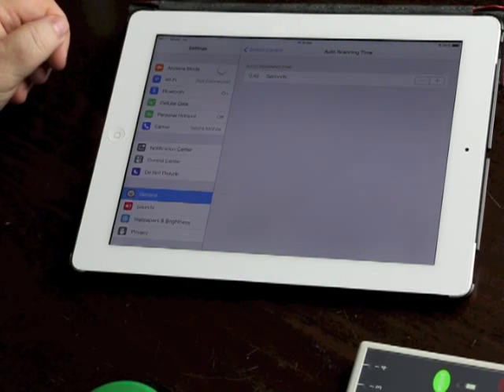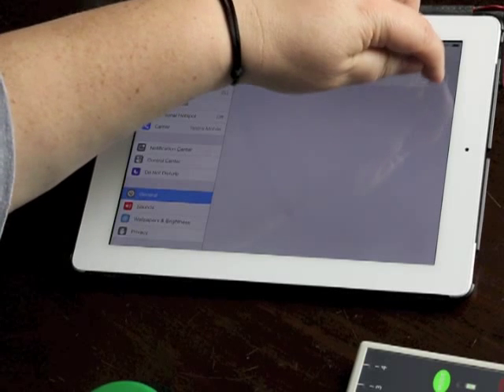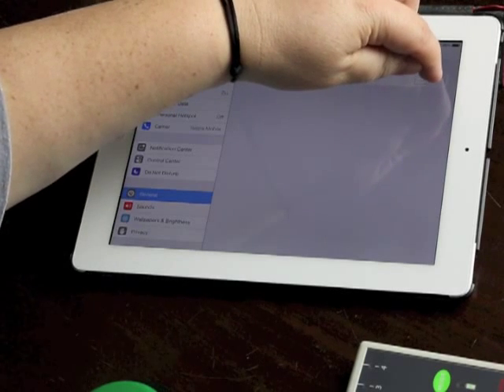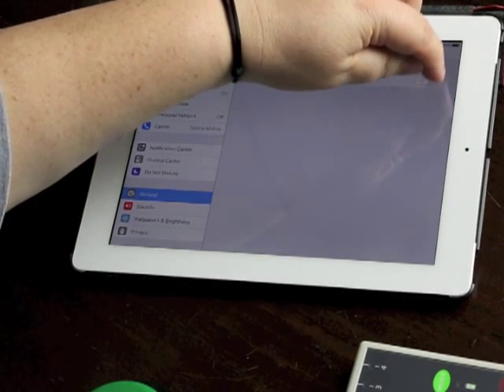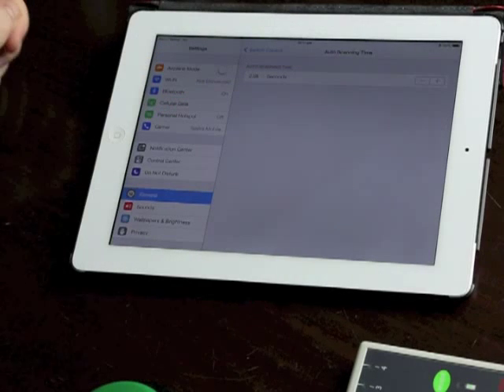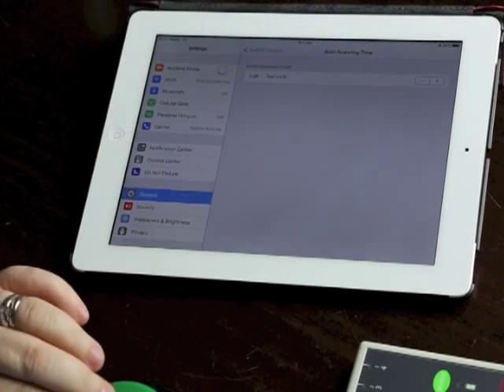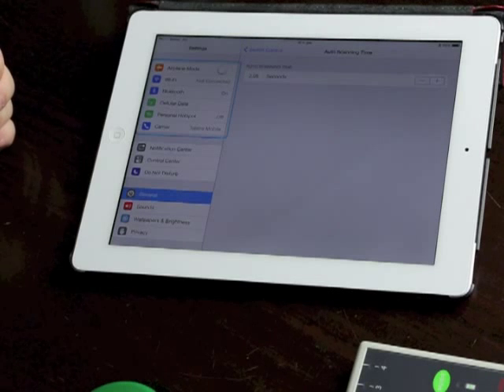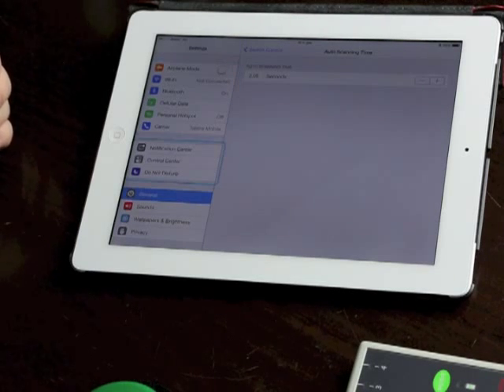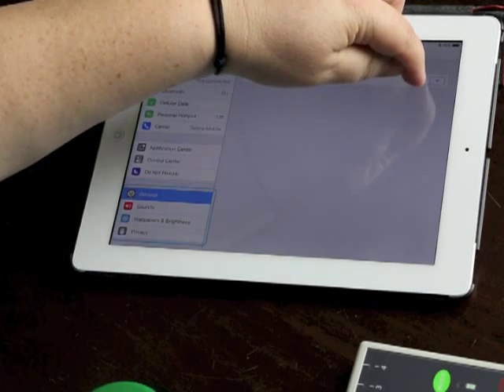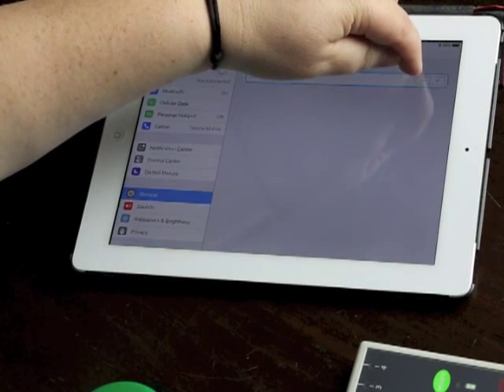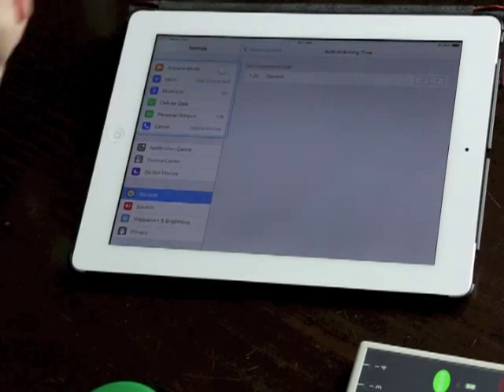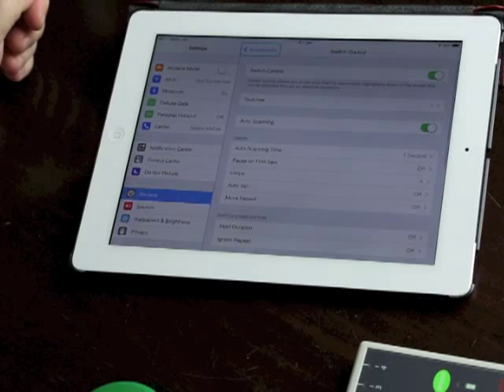And I can make it really quite slow so I could increase it, well at the moment it's 2.05 seconds. So I hit my switch and it's going to move much more slowly around the screen. I'm going to go back to the default of one second because I find that's quite comfortable for me and we'll go out of the scanning time.